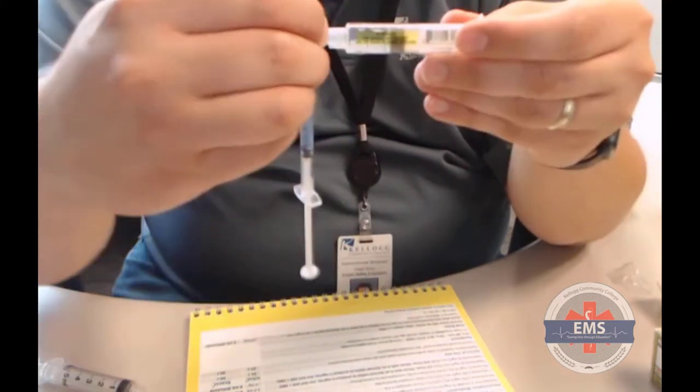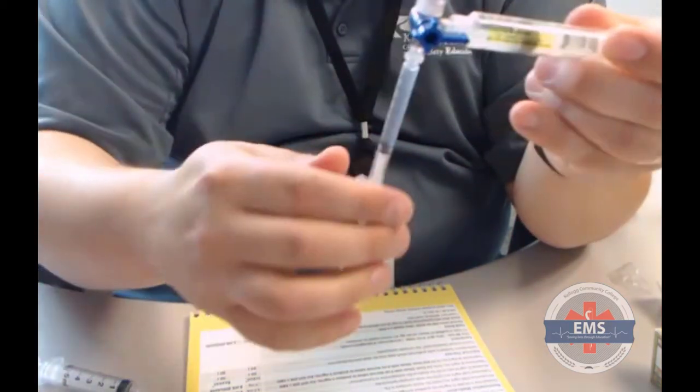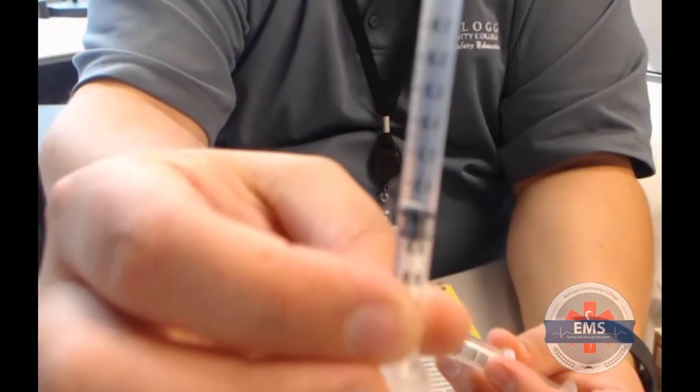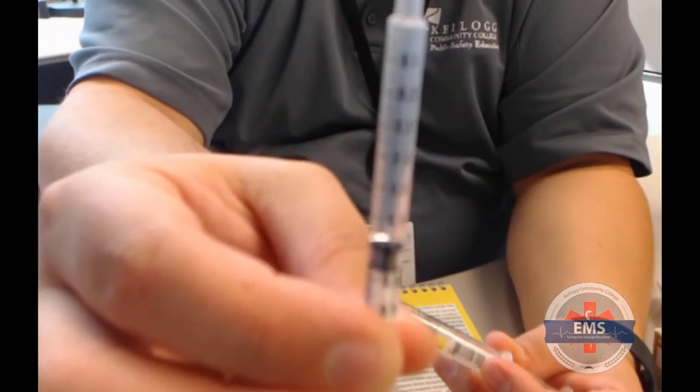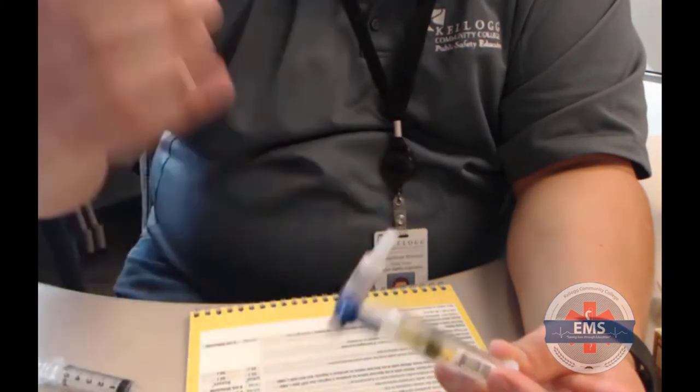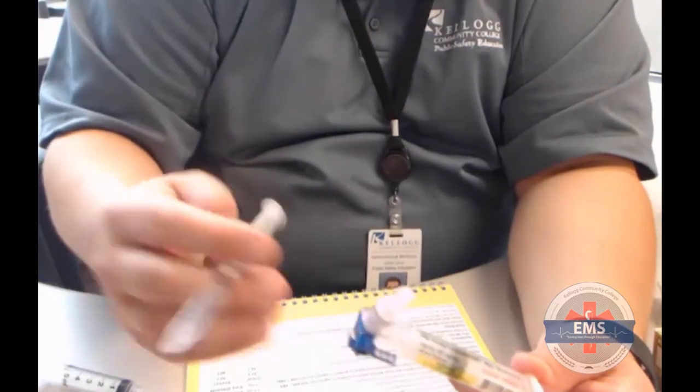0.7. Turn my stopcock back to off so I don't waste any medication, and now I can remove this. You can easily see in here, hopefully, my camera will focus, that I'm definitely at 0.7 milliliters. And just that easily, now I can go ahead and give this dose.